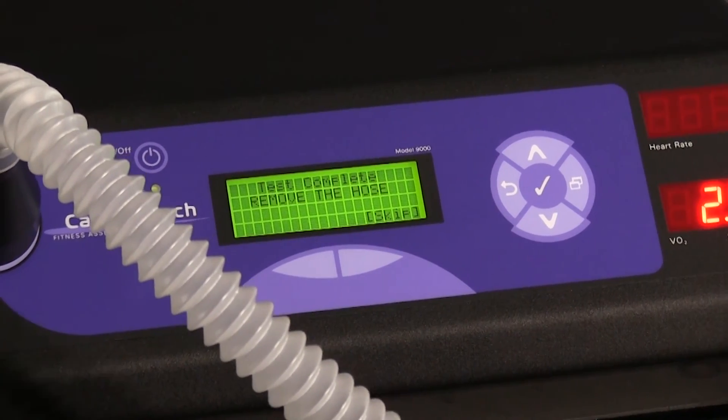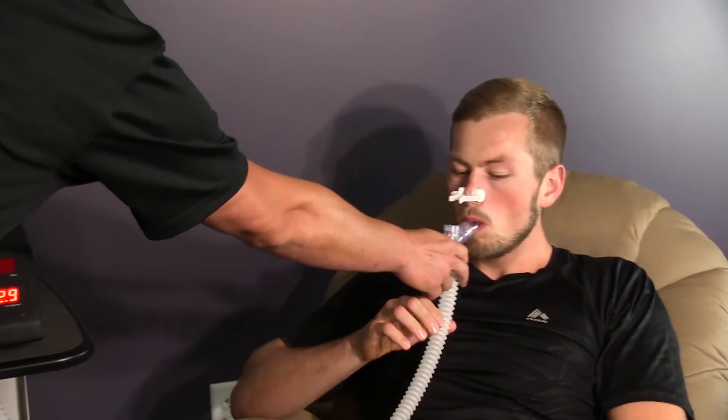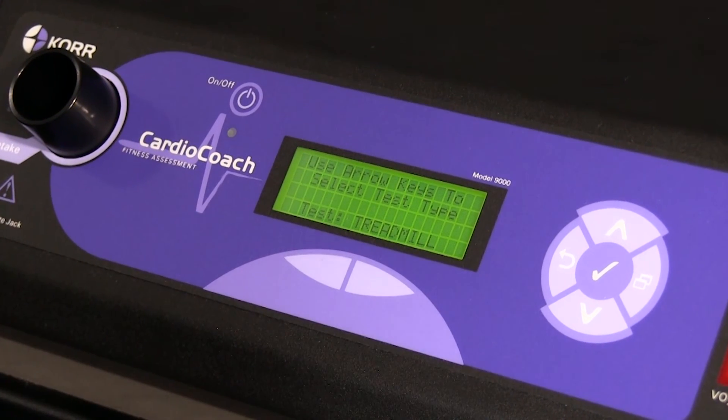When the test is complete, the unit will beep. Disconnect the MetaBreather tubing and throw it away. You can print the results using the soft keys below the LCD screen. After the results have printed, you will be ready to interpret the results for your clients.